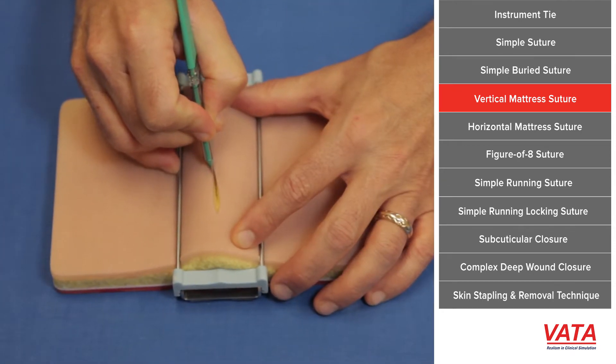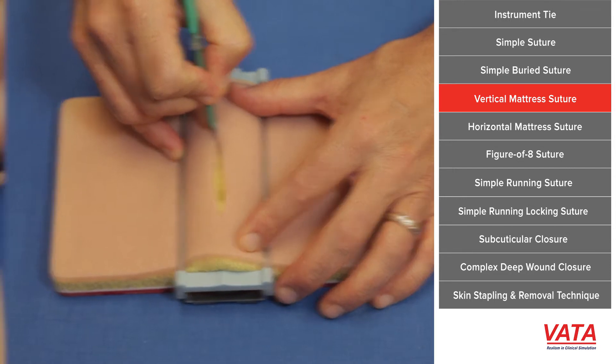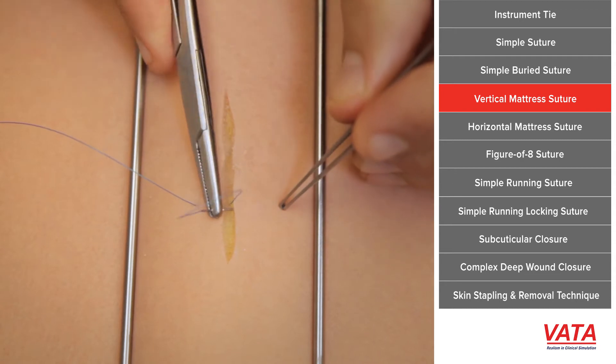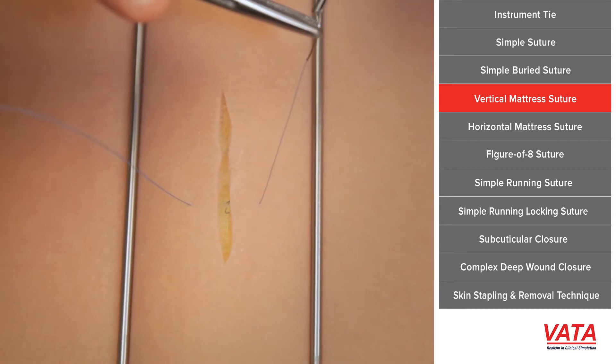And when we go ahead and make a cut here, what happens is the skin gapes open. In order to take tension off this, sometimes a simple suture will just pull through and we'll do a vertical mattress, which some people call the far, far, near, near.